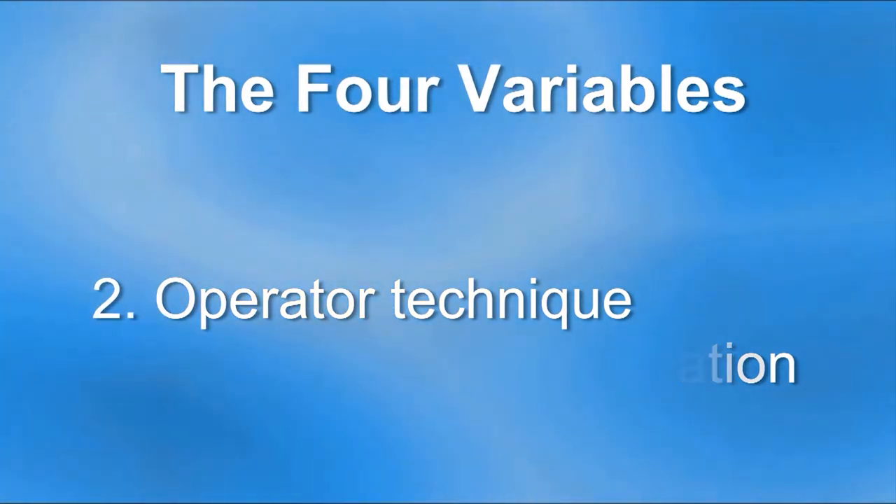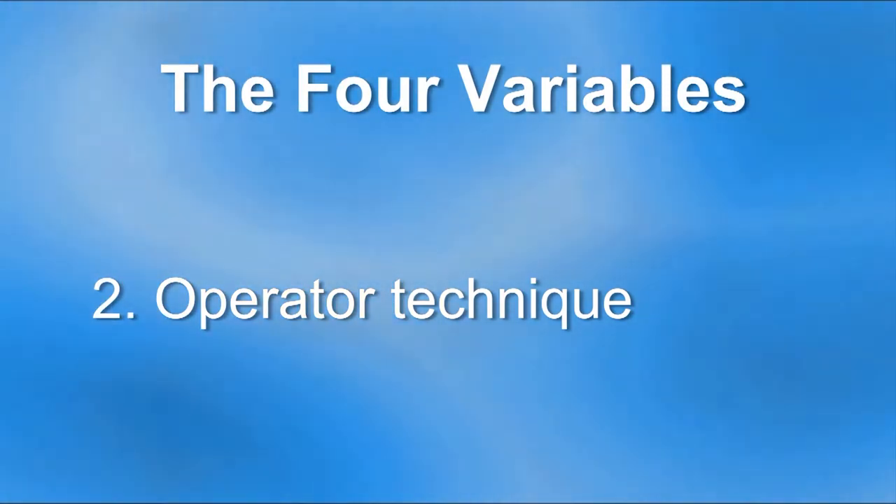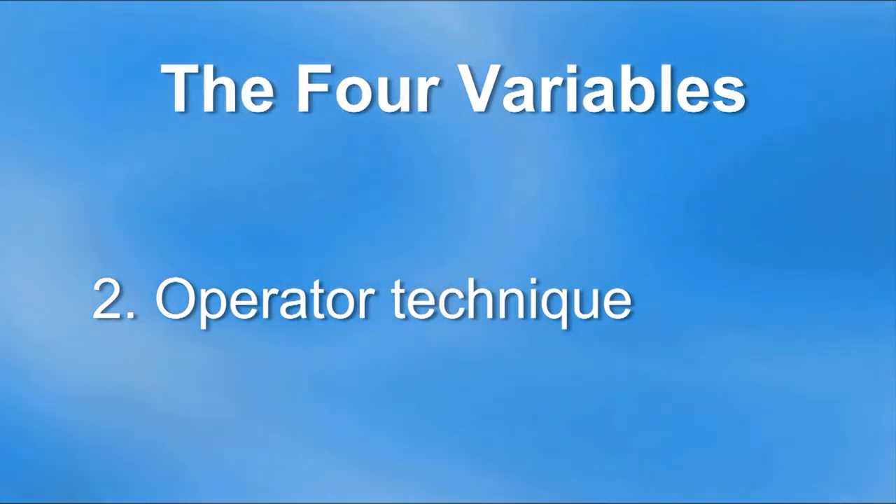This video will focus on the operator technique and the effect it can have on the amount of energy delivered. The next clip will show what happens when curing a resin in a typical dental office.